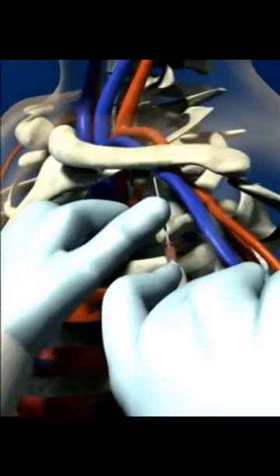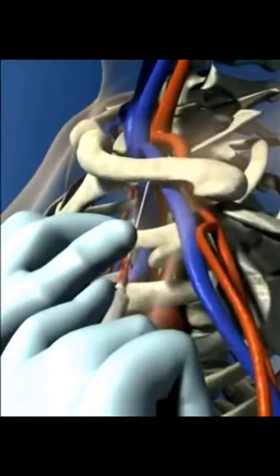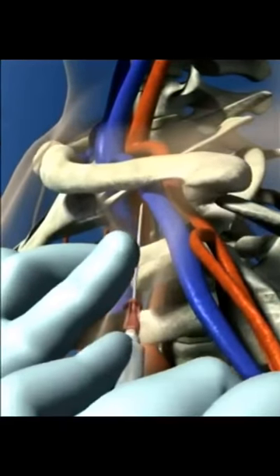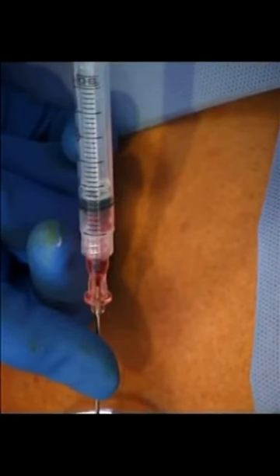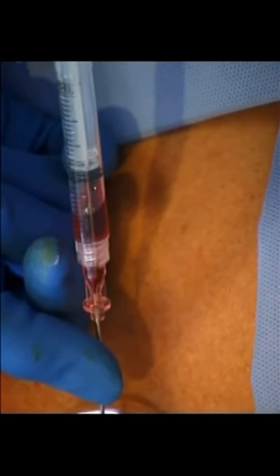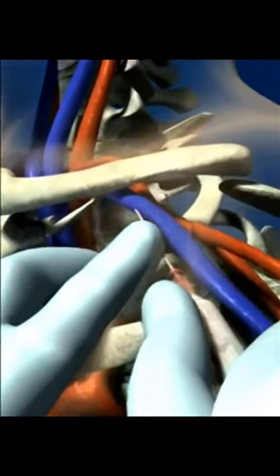The needle is advanced until the clavicle has been encountered. After gently touching the clavicle, the needle is pulled back and further downward pressure is applied as the needle is advanced just below the clavicle. While this is being done, constant negative pressure is maintained in the syringe, and a flash of blood in the syringe indicates the vein has been entered. If no flash of blood is encountered, the needle is slowly withdrawn, again while maintaining negative pressure in the syringe, as the vein is often encountered while withdrawing the syringe.